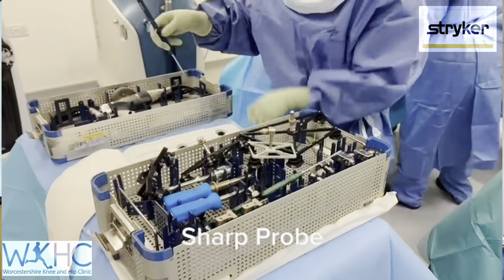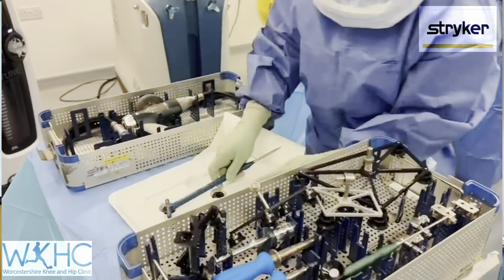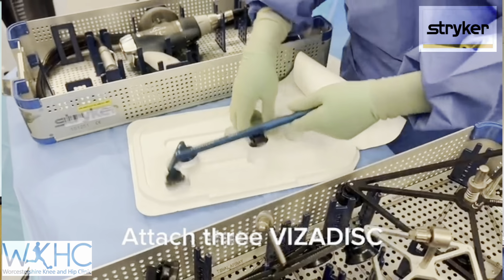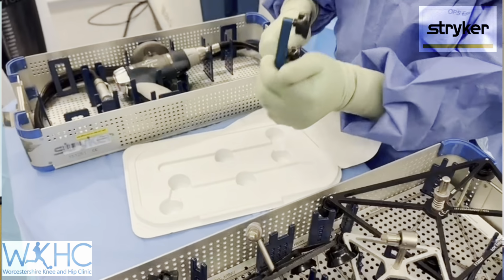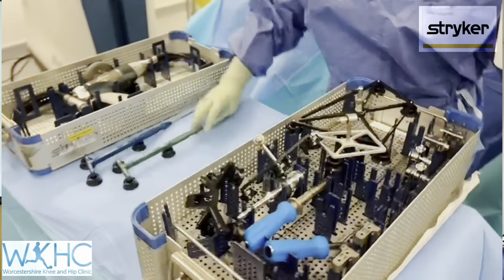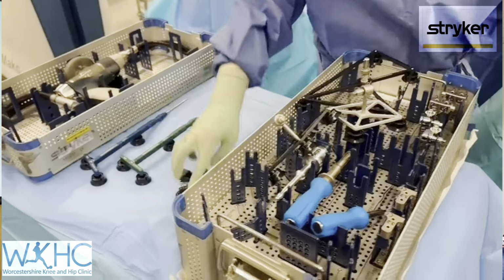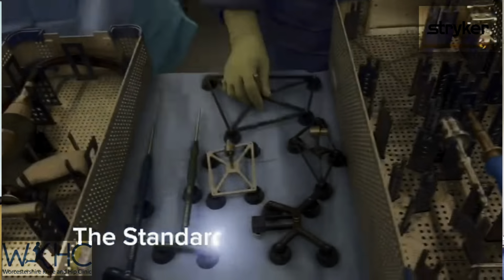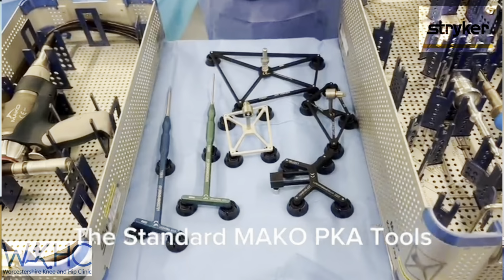So the sharp probe is the blue one. The blue one is used to map the bone. And these probes have 3 discs. So again, make sure that the discs are down and clear. While you're doing all this, your colleague is preparing the trays, so you've got all these ready, and that's your standard Mako setup.